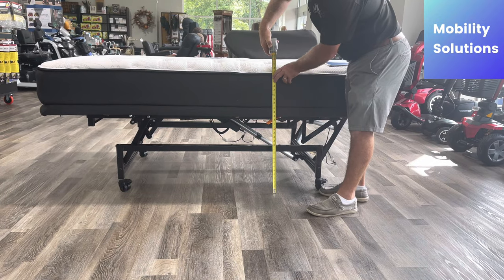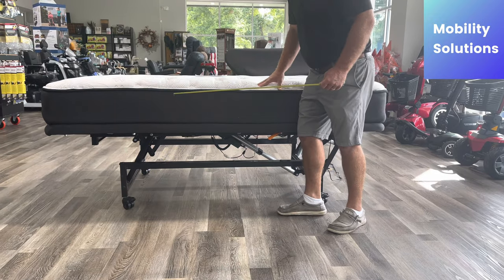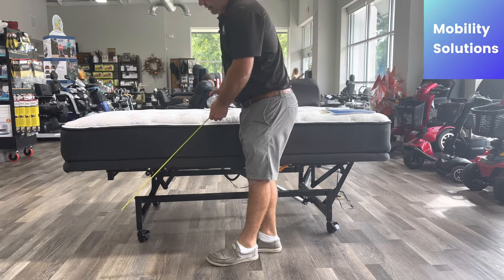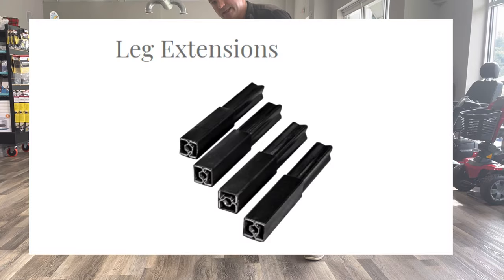Right now we're sitting at about 29 inches in height with these caster wheels. These caster wheels allow it to roll, and if you need to roll it they do have locks on them. But you can take these caster wheels off to make it two inches shorter, or you can add leg extensions.